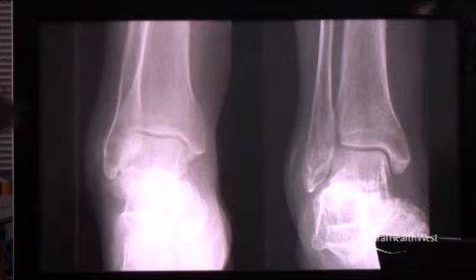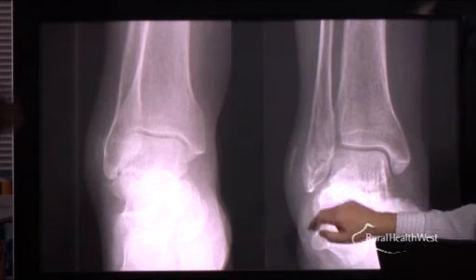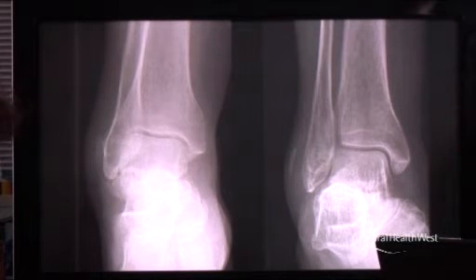but you would normally expect to see, if it is a fracture related to the ankle joint, blood in the ankle joint in the acute setting. We often see fractures of the lateral malleolus, particularly distally where the collateral ligaments insert, and you may pull off a flake of bone with an anterior talofibular ligament type injury.